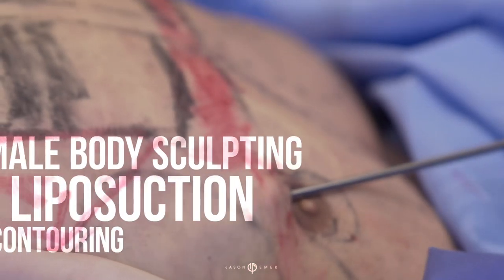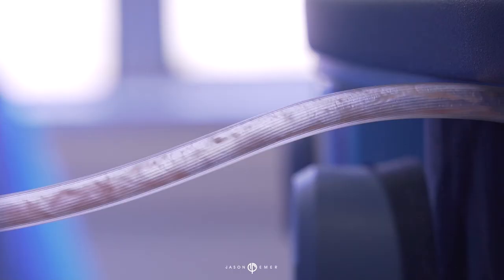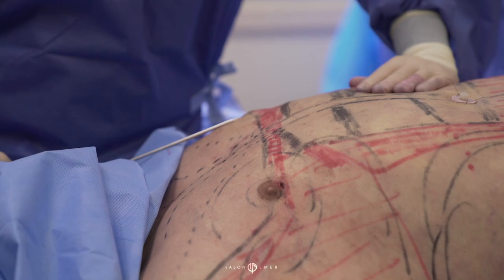Hey guys, it's Dr. Emmer. We're now extracting fat as a power-assisted liposuction after we've already done ultrasound. You can see the nice purified fat coming out of the cannula after we've done ultrasound therapy.